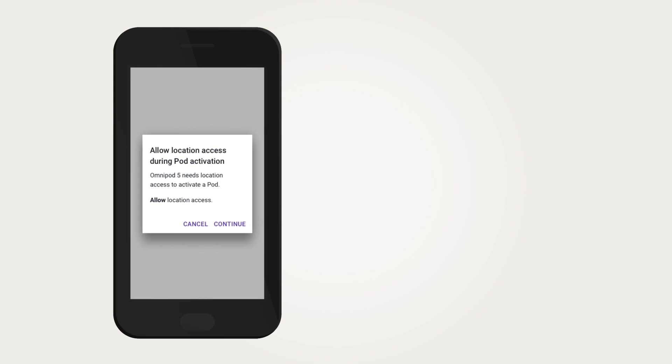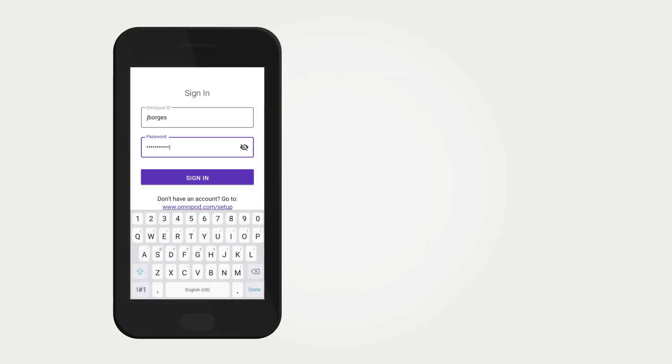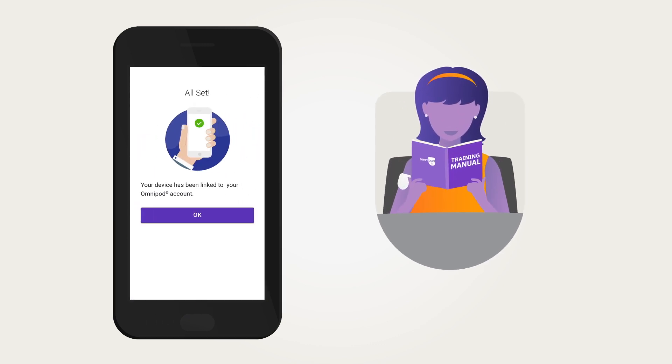When using your own compatible smartphone, there are a few settings requirements needed to use the app. During first time setup of the Omnipod 5 app, you will be directed to a website to create your Insulet profile. During this process, you will create an Omnipod ID, link accounts including your data management account using your healthcare provider's unique code, select training preferences, and engage in e-learning courses. Once complete, you will be asked to enter your Omnipod ID back in the Omnipod 5 app. If you intend to use the Omnipod 5 app on a compatible smartphone, you must first log into the app on the provided controller.